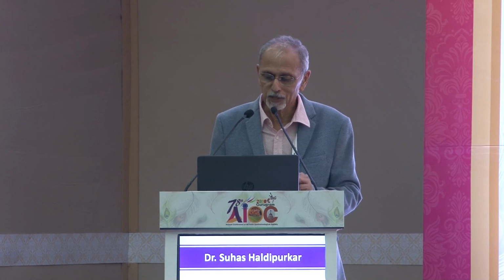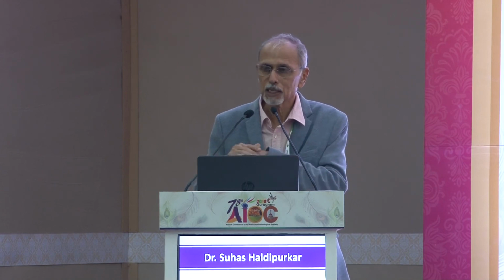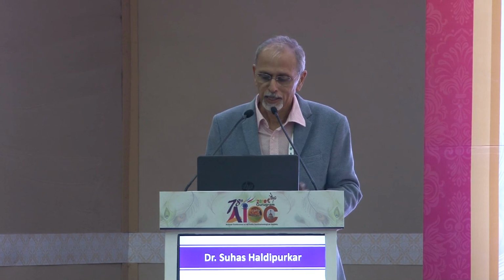So at the end of the surgery, when you tie the knot and get the pupil in, it doesn't get stuck onto the iris, and because of traumatic mydriasis, this patient needs pupilloplasty on either side, and at the end of it you have it.